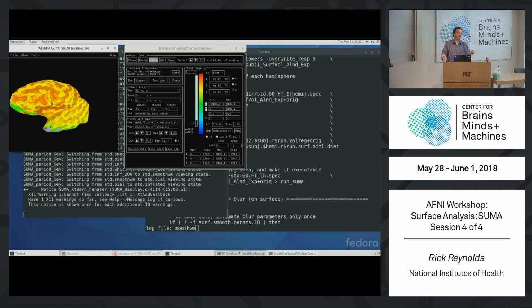But you want to understand what it's coming from, so it shouldn't be a strange artifact. So you want to look at these things and be sure you know why you're seeing what you're seeing.